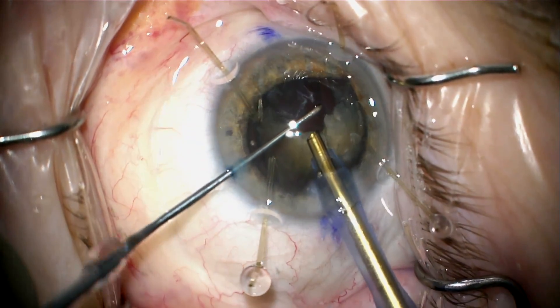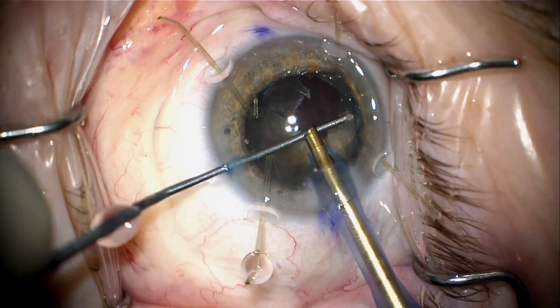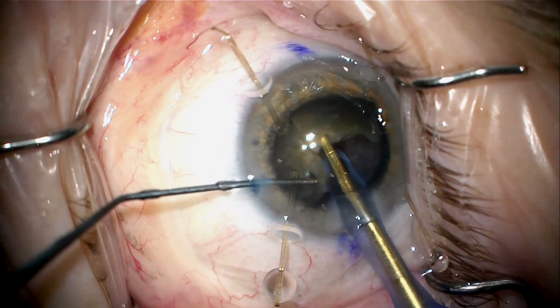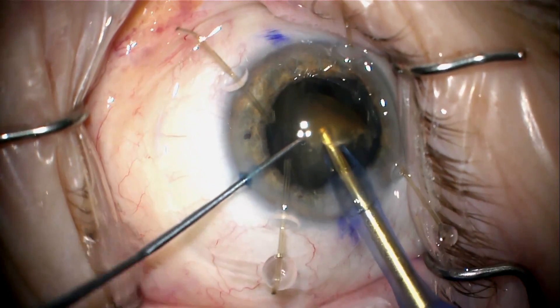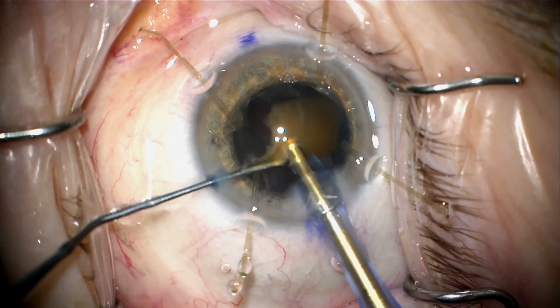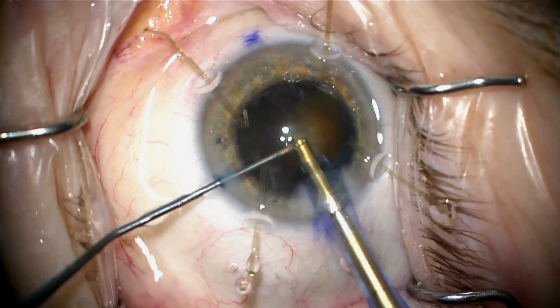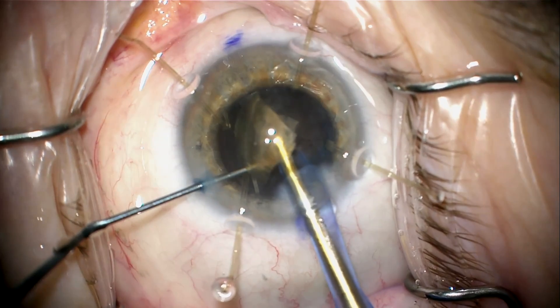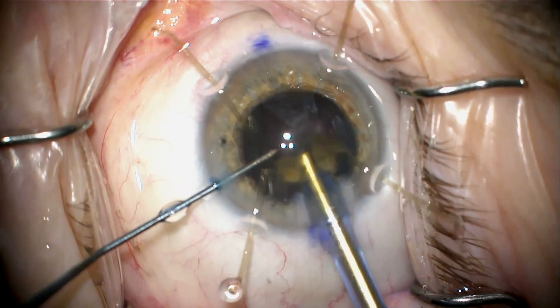The phaco here is a bit edited to show the main portions of what was done. I created a few chops to create quadrants and then pull the quadrants out of the bag, trying to stay in the middle of the pupil to avoid hitting the edge of the capsulorhexis with the phaco tip and causing a radial tear. I do my chops and bring the quadrants up.